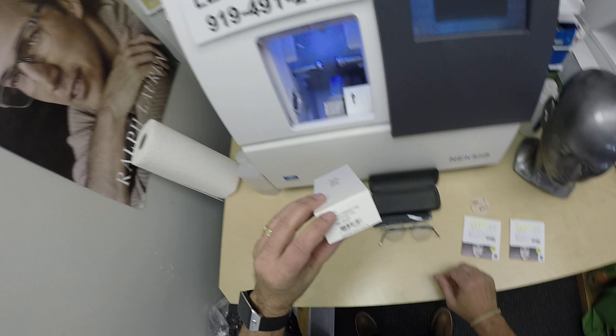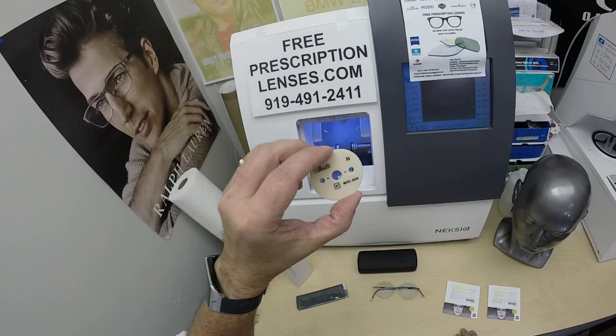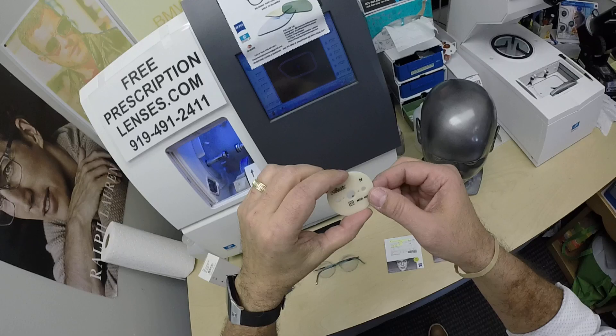It is color 5040. They are teal, 17 bridge, 145 temple length. It comes with the Silhouette case and the Silhouette cleaning cloth. Macy got shape 4535 and the 47 eye size. This is the pattern I use to cut the lenses.